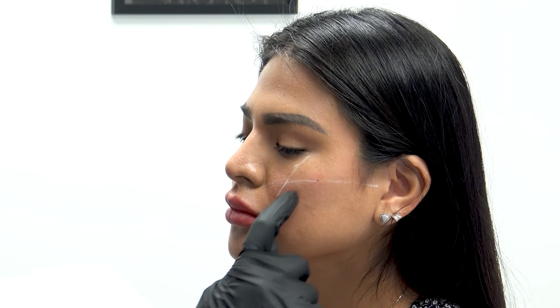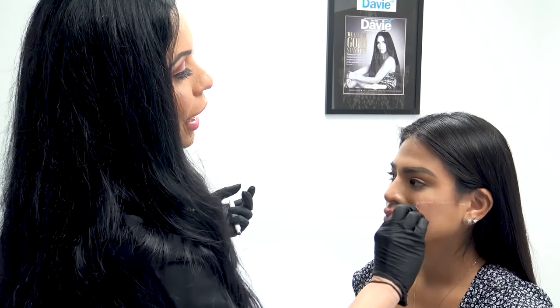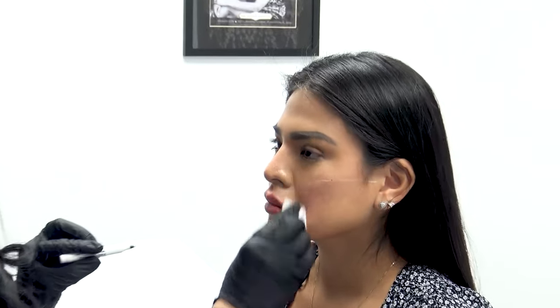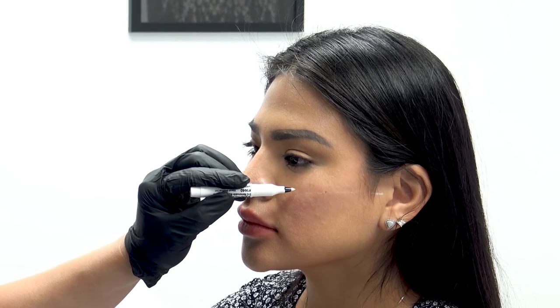When she smiles she loves how the apple accentuates, but in a neutral position everything drops a little — that's this area here. Typically that area is a little bit on the dangerous side for injecting, so it's not recommended for a beginner injector. You're guiding yourself by the pupil, and this is the territory of the infraorbital foramen where the neurovascular bundle comes out, so you want to be very careful that you're not in that area.